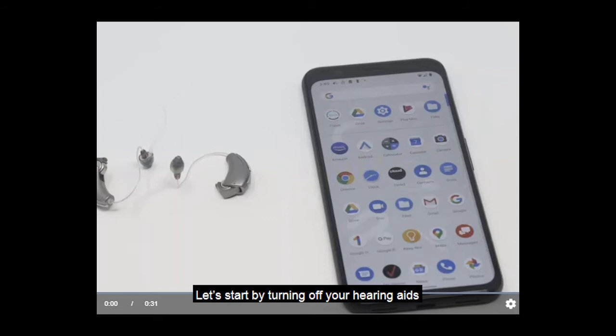Let's start by turning off your hearing aids. Please remove them from your ears and open up the battery doors. Then let's make sure we have the Thrive Hearing Control app downloaded on our Android phone. This can be done through the Google Play Store.